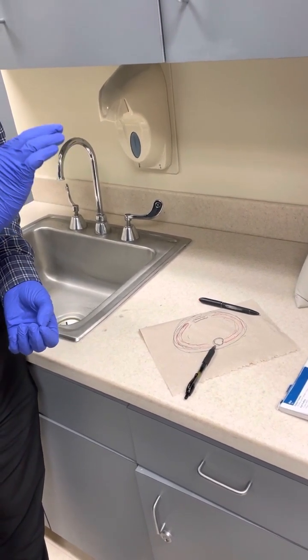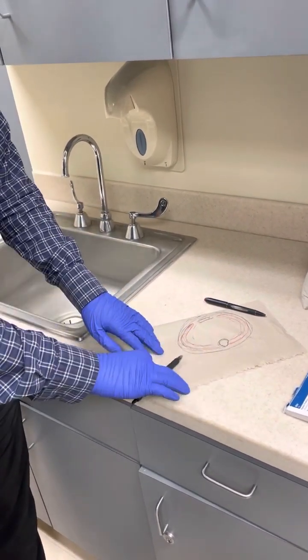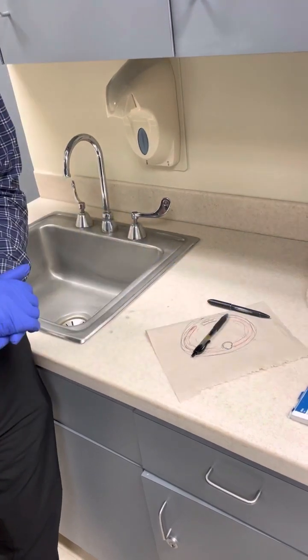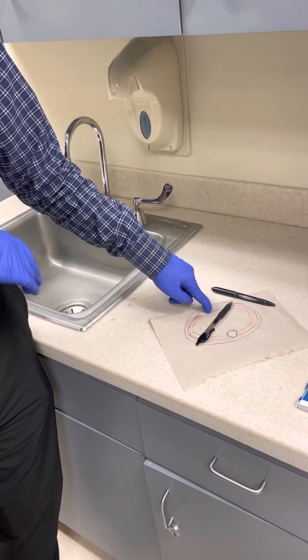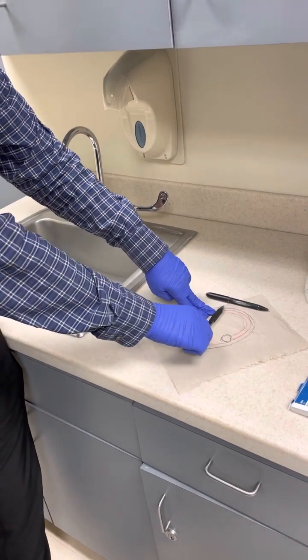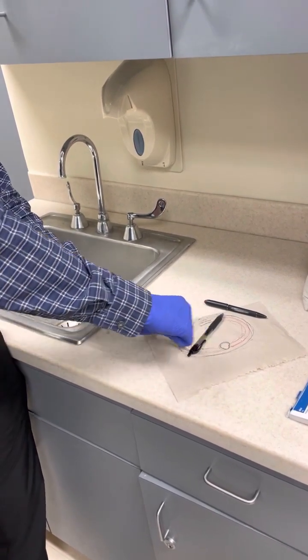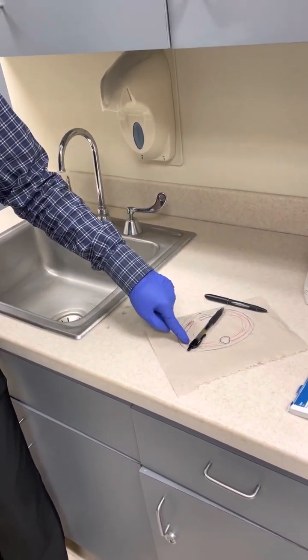It makes no sense, right, for you to try and do this for the right ribs because the spine will be on top. But if the X-rays were coming through like this, now we see the ribs without this superimposition. Does that make sense? Sternum's really thin. It doesn't really show up unless you force it to show up. So sternum doesn't matter, right? It might as well not be here. And so you can see all these left ribs without superimposition. You elongate them nicely, you see the size of them. Right? So an RAO is used to look at the left ribs.